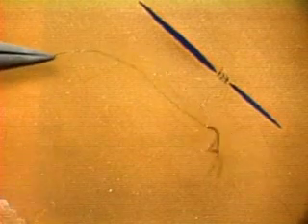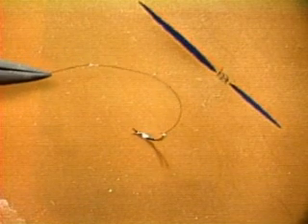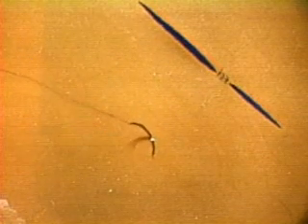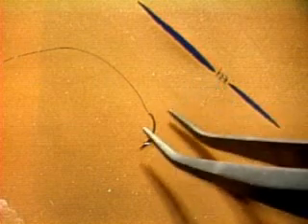Now lift the thread straight up and dangle the needle so it just touches the flat underlying surface. By moving the thread around, you can make the needle point in almost any direction. In this way, get it to point roughly in the direction you want, which is toward the bottom left. Now you're ready to pick it up.